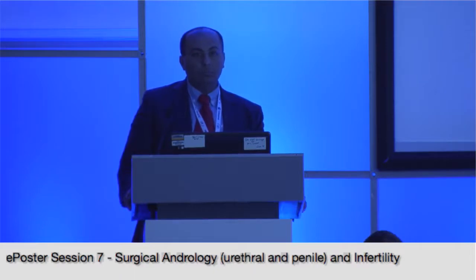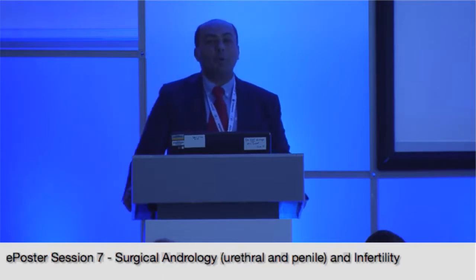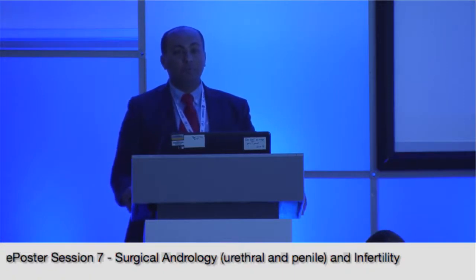Just a quick one. Have you tried it without a vacuum device? Because there are some papers in the literature showing a vacuum device alone has potential in improving the curvature. Yes, we did that paper, actually. So we are combining Xiapex with vacuum to maximise the response. There's a clinical trial just finished, exactly the same as the IMPRESS, but this time using the vacuum device. So with the IMPRESS, it was 18 degrees. With the vacuum device, it's 25 degrees.